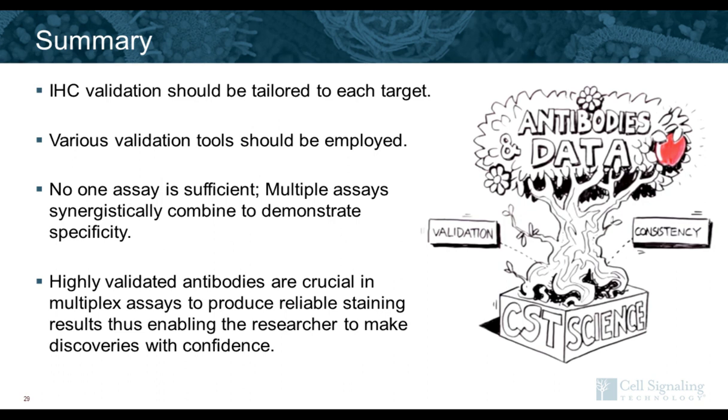Using just an unconjugated mouse monoclonal primary antibody, you would run into issues with secondary detection and mouse-on-mouse reactivity. Got it. Thank you. How would I get the protocols for using multiple OPAL dyes on same species antibodies?